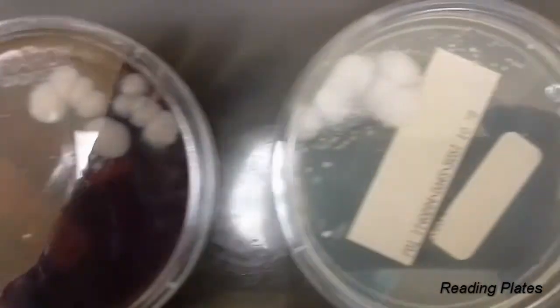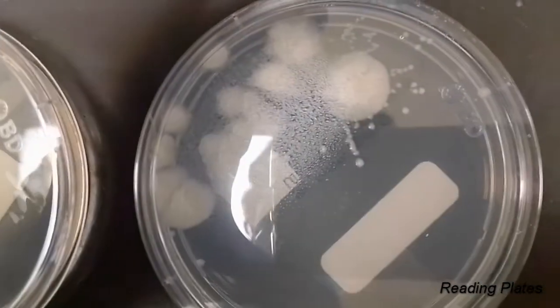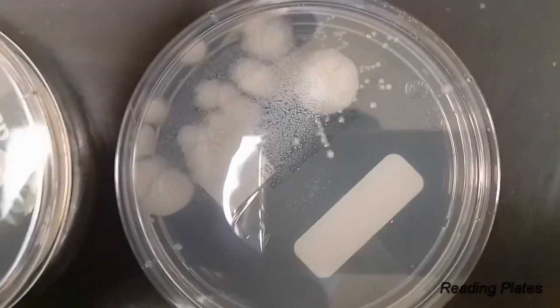When it comes to reading plates, you're going to be doing this probably a couple of times a week for the whole four-week duration. Obviously you're going to be on the lookout for yeast or mold. Remember you have at least two different plates — one is going to be selective and one is going to be non-selective — so you can compare the growth on each of those different types of media.